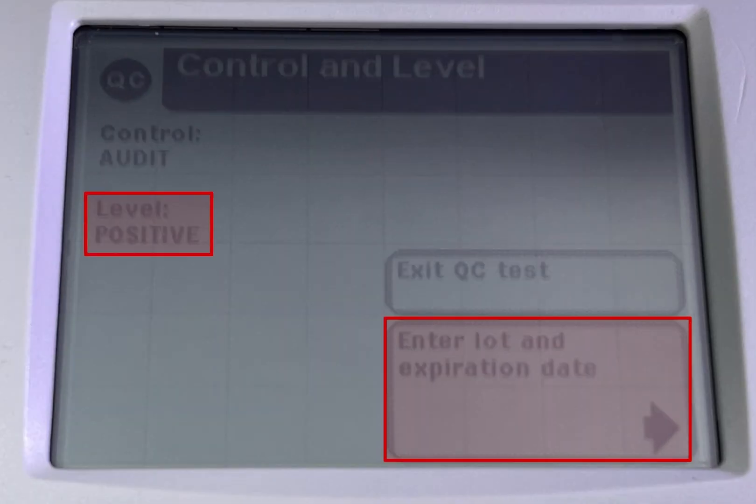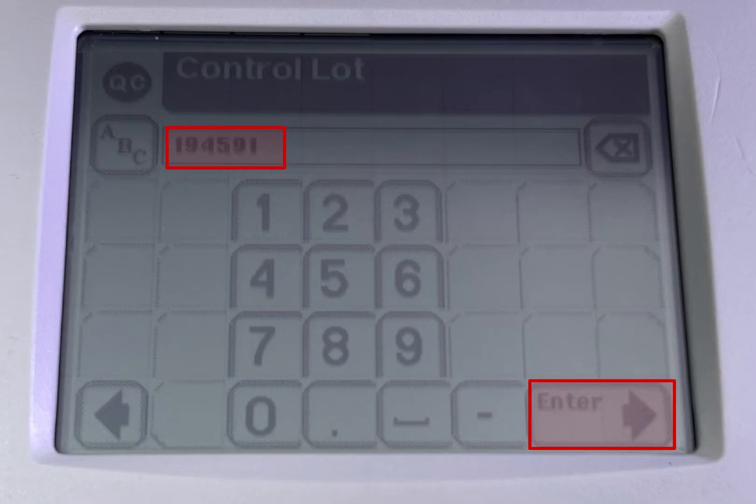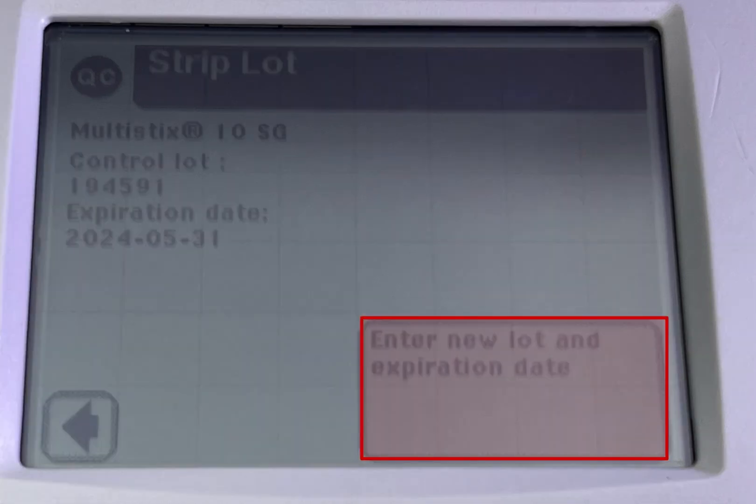Level positive. Click on enter lot and expiration date. Scan the positive QC control lot barcode on the card, then click enter. Add the expiration date and click enter.